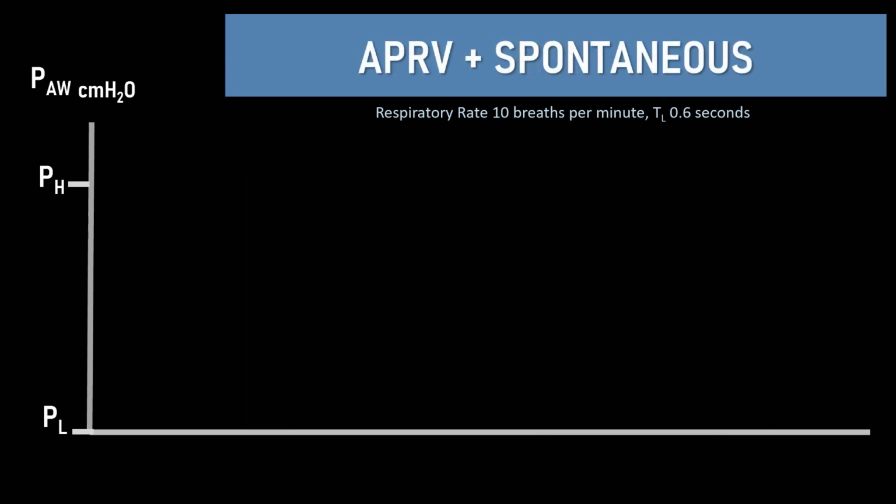Harry has been paralysed with neuromuscular blocking agents for 2 days, and we've diuresed off several litres of fluid, and now we need to allow his diaphragm to work to prevent further diaphragmatic atrophy. To allow Harry to breathe spontaneously, you need to use the bilevel mode. APRV can be achieved with difficulty in volume control and fairly easily in pressure control, but spontaneous breathing really requires the active exhalation valve that I discussed in the tutorial on bilevel pressure control.